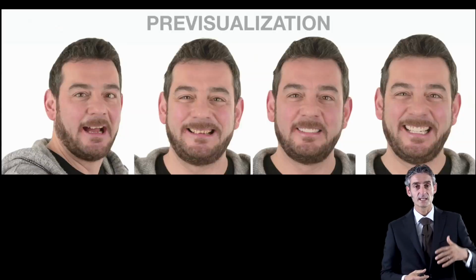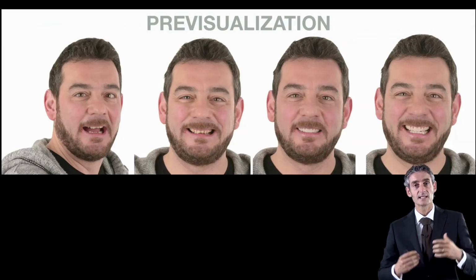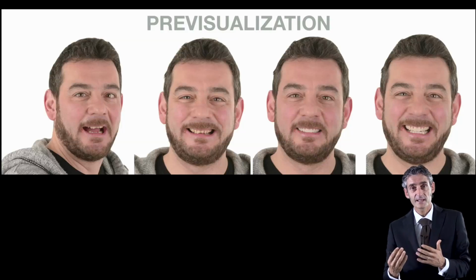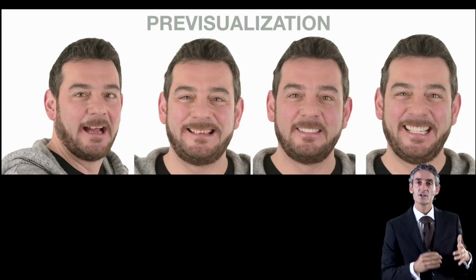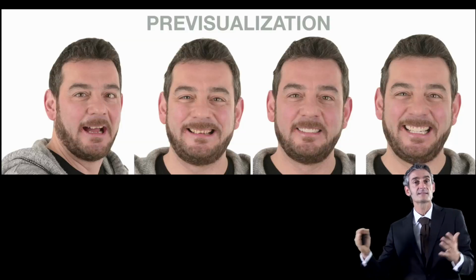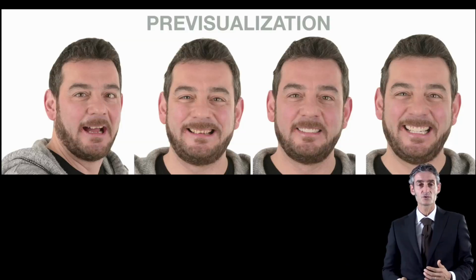And with this, we can immediately understand if our idea of aesthetic is what the patient wants. So if the idea that we have in our mind is in some way the desire of the patient, and everything is fine, we can step forward and analyze the case a little bit and then start the second part of the case, so the surgery or implant placement or whatever.